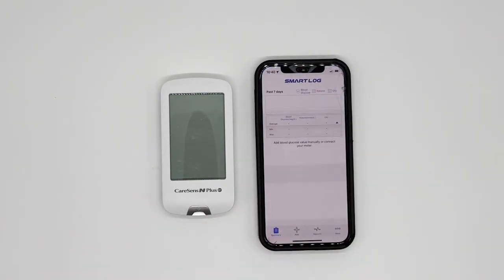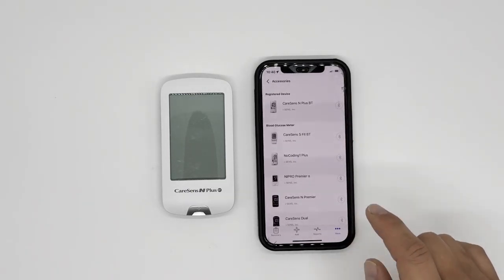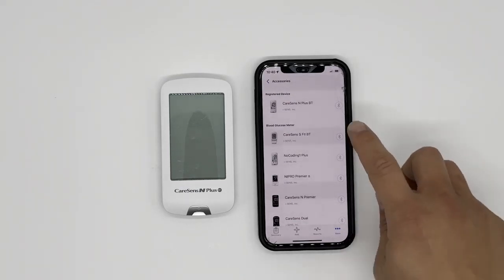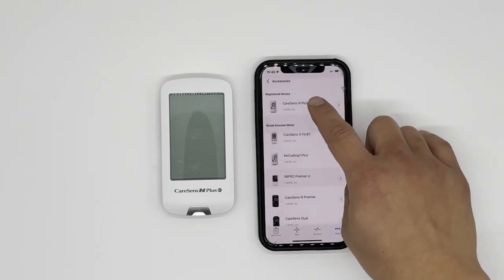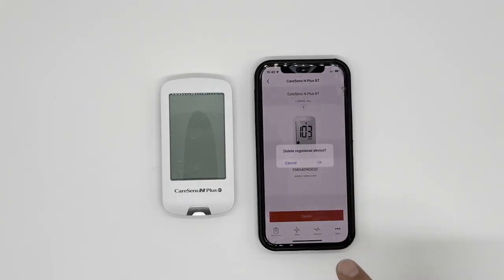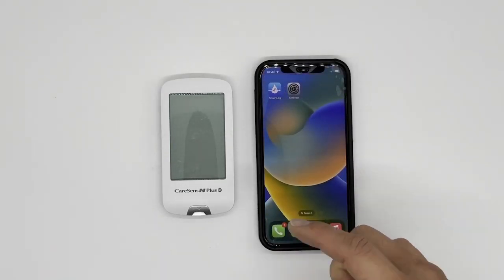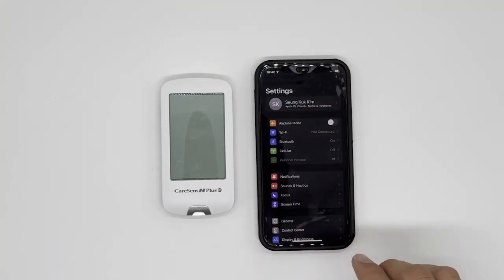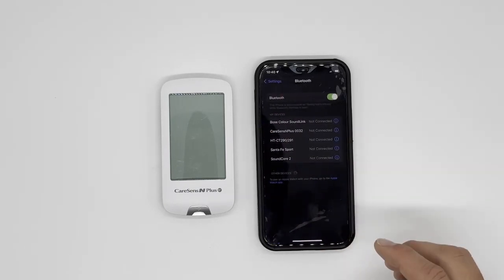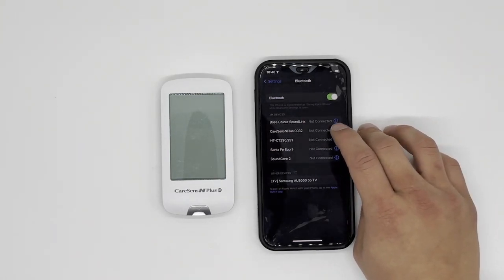This is the main screen. Go to More on the bottom right corner, second from the top — Accessories. You may or may not see this on your phone, but under Register Device, you'll see CareSense N Plus BT. Click that and delete this device. Press OK. Now let's go to your phone settings, where you can find the Bluetooth device list. If you see CareSense N Plus and four digits, it is very important to disable or forget this device.